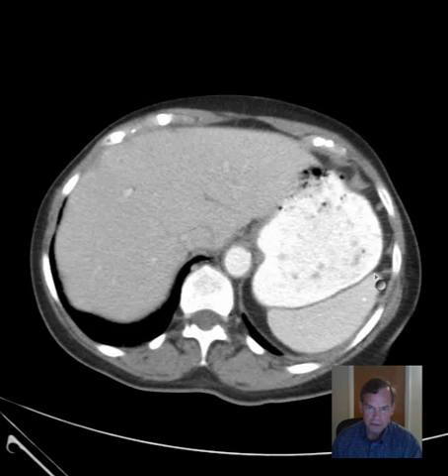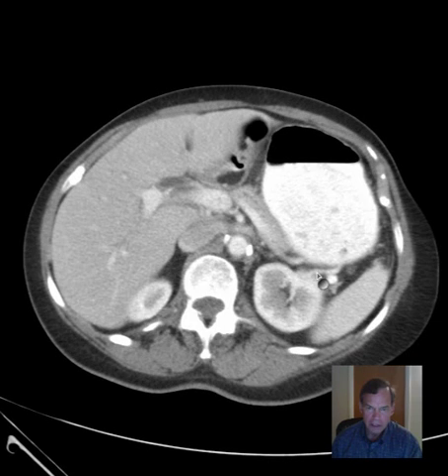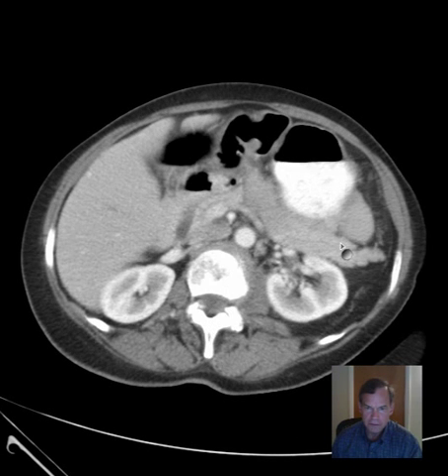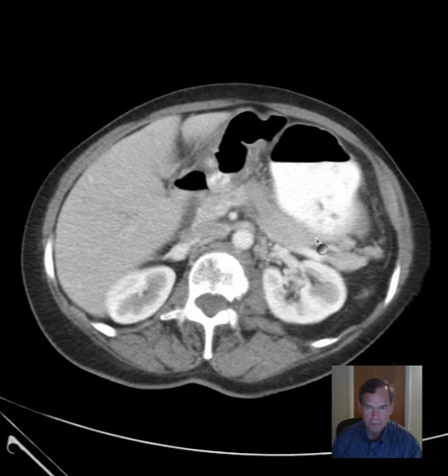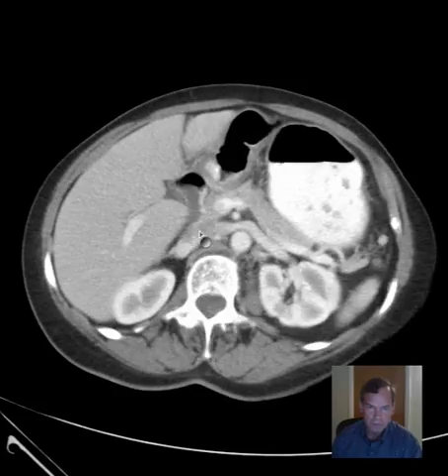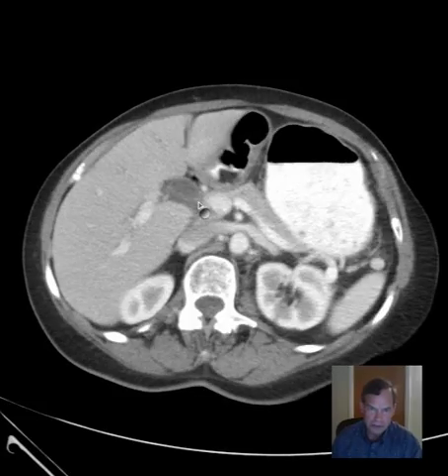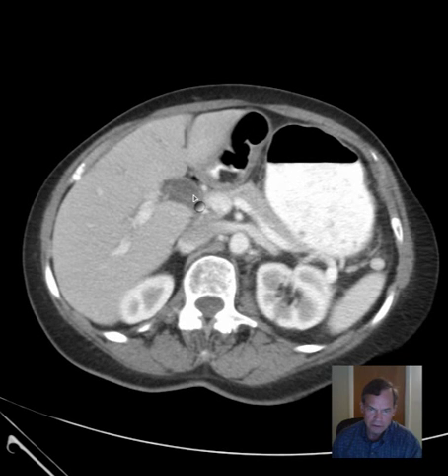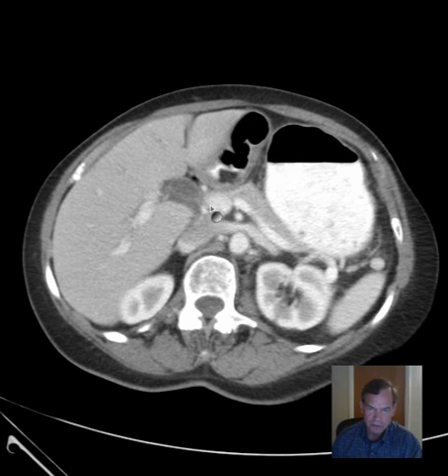The spleen and the pancreas appear unremarkable. The patient has apparently status post cholecystectomy. I don't see a gallbladder, but the common bile duct is a little prominent there, probably about 12 millimeters.